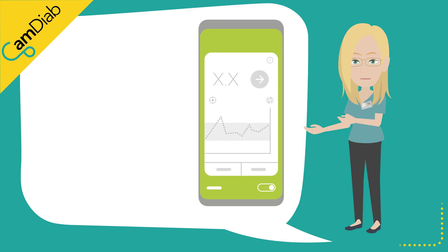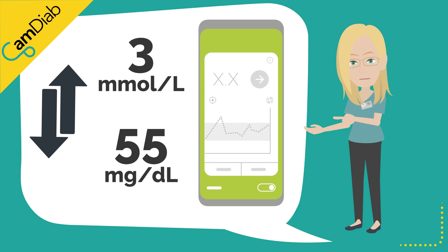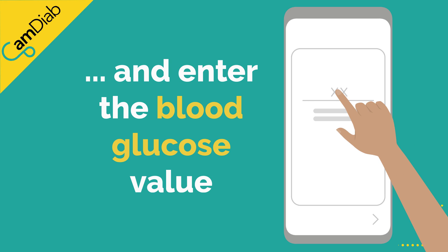The Dexcom and Freestyle Libre sensors are factory calibrated and therefore routine calibration is not necessary. A sensor is generally classified as being inaccurate if it is over or under-reading by 3 mmol per litre or 55 mg per deciliter at a time that the glucose trend arrow is stable. To calibrate the Dexcom sensor, open the MyLifeCam APS-FX app and tap on the blood drop. Enter an accurate blood glucose finger prick value that has been taken with a calibrated blood glucose testing meter.